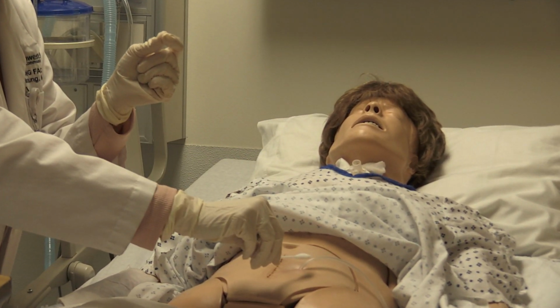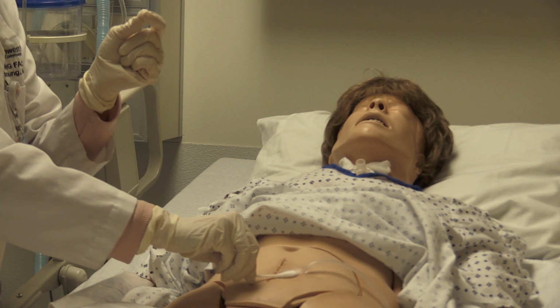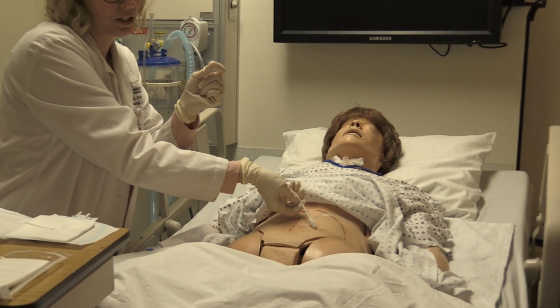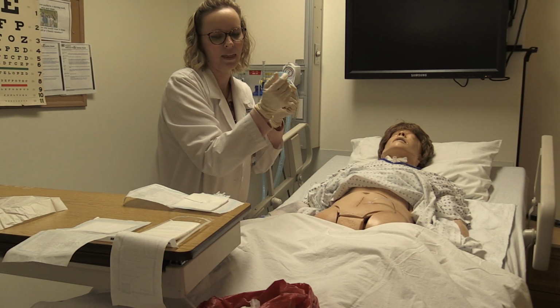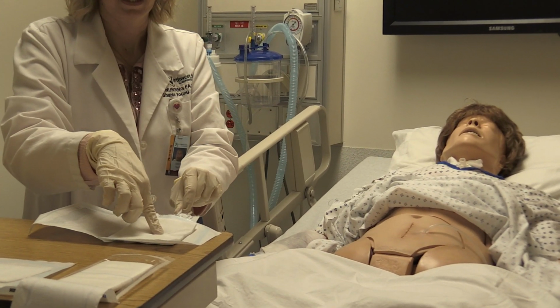What I'm going to do is I'm going to make a C. So I'm going to kind of go on that side. I'm just going to kind of roll as I make a backward C. And I just kind of want to make a little circle. And then I'm going to throw away my swab stick without contaminating or crossing over. I'm going to go ahead and get the next one.